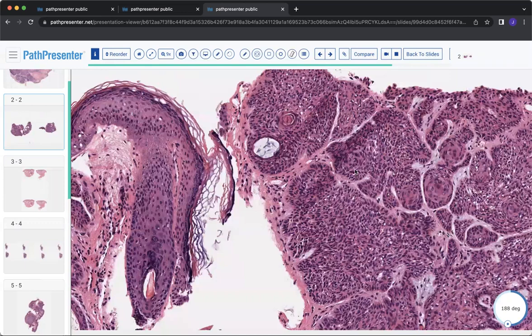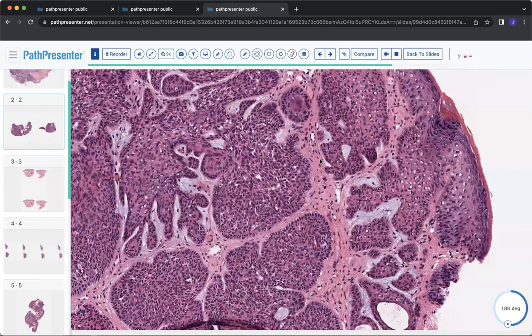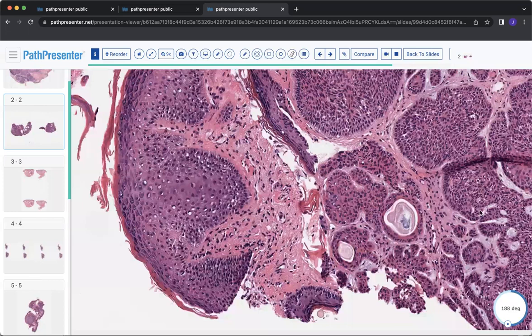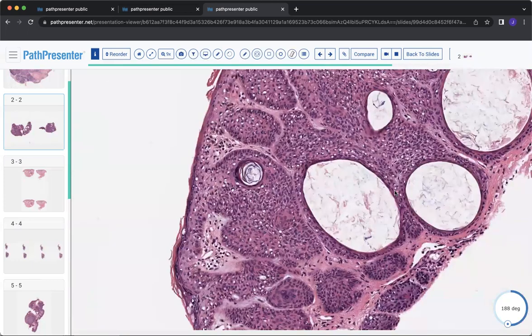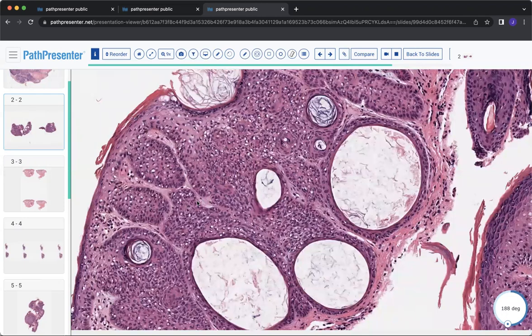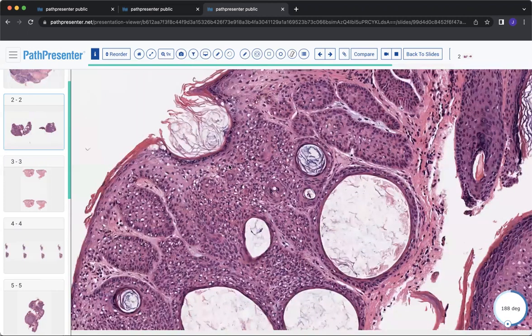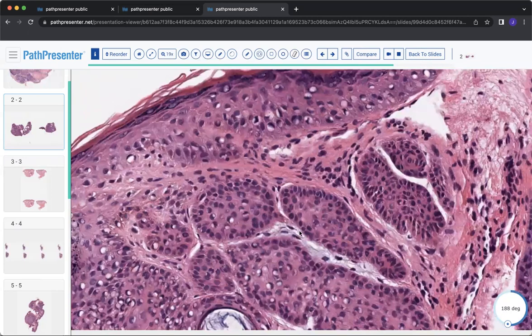So taking this all together, and if you remember the discussion from the last unknown that we just had, you're probably considering a trichoepithelioma, and that's what this was called here. So the most important things to differentiate this, at least architecturally and histologically, when you're trying to separate out from a basal cell, is going to be those factors of the milia-like cysts along with the tight adherence of the surrounding stroma to the basaloid island and not direct cleft and retraction right next to the island, as you would see in most basal cells, along with areas that you might say, well, it's swirling, it's looking like it's a papillary mesenchymal body forming. Those are going to be your main differentiators.